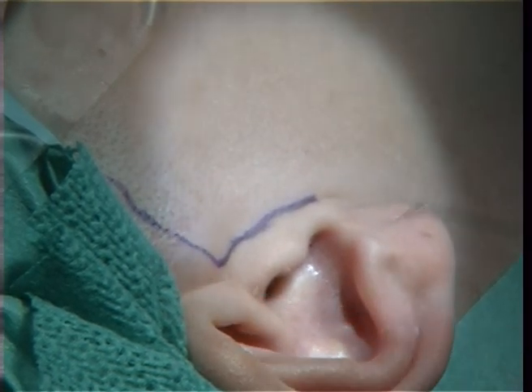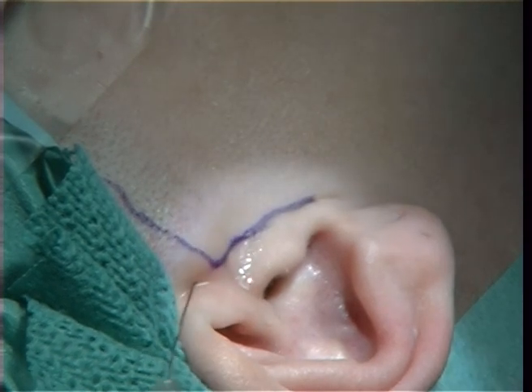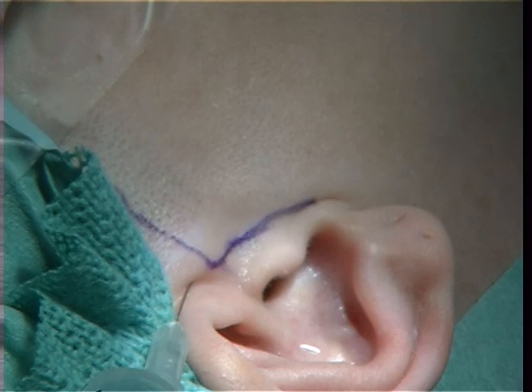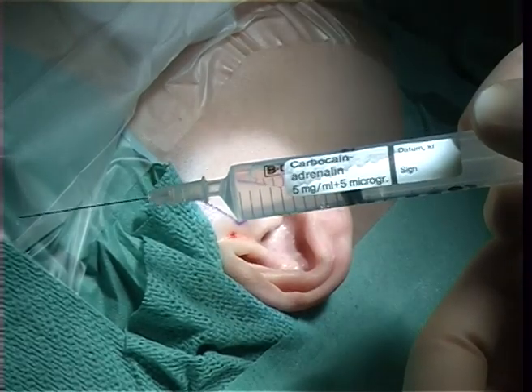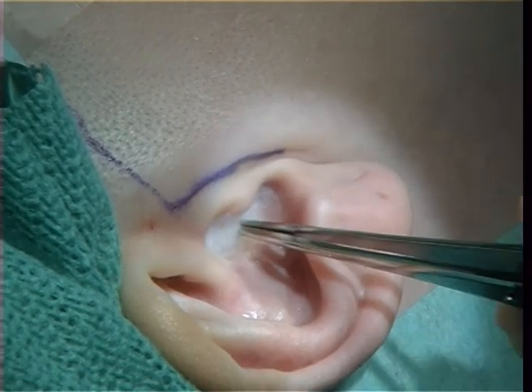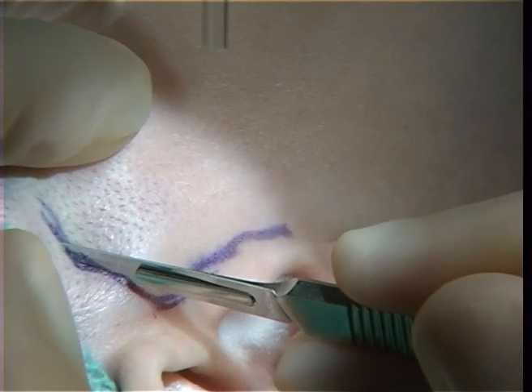We give some local anesthesia to avoid bleeding. There is adrenaline and carbocaine in the syringe. We also put some injection down over the joint area.